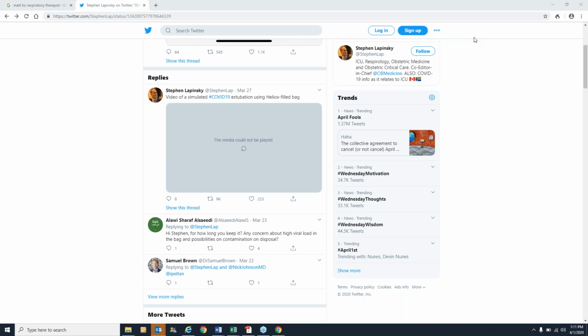Okay, next comment: the CAS is recommending taping the joints of the HME, the accordion tubing, inline suction elbow, and ETT, leaving the connection on the clean side of the HME untaped to reduce accidental disconnects during the perioperative time. Our ICU RTs have been told not to do this. What are your comments?